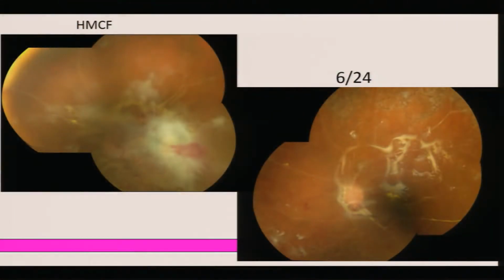And once I get rid of most of these peripheral membranes, I did a PFCL injection for me to settle the retina, and I could see the retina settling really well in this case. And I never forget to do peripheral base shaving in any of my cases with retinal detachment, and then did a laser, and then did a silicone oil exchange in this case. And you can see the patient improved from hand movements close to face to 6/24. I thought I was lucky enough to have that, and what you can see is a little bit of oil reflexes.